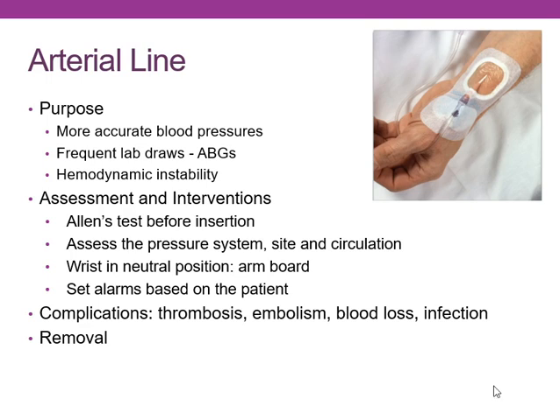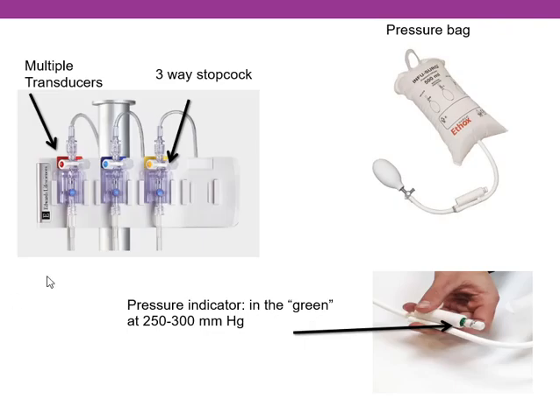Now, a thrombus or an embolism on the end of the catheter. If we think we have one of those, the last thing you would want to do is actually go flush your system. You flush the system. I'm actually going to go back one slide so that you can see. These little blue dots here, actually, they're called pigtails, and you pull them, and what it does is it flushes the system. It sends the fluid through the system. So your nurses may have you do that.